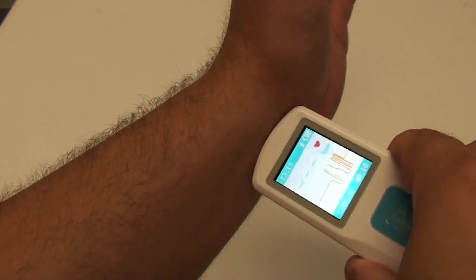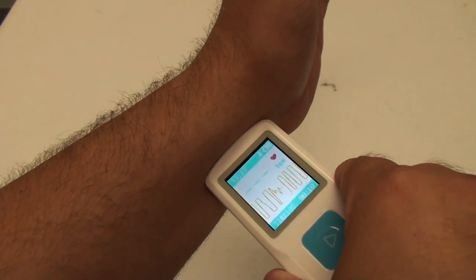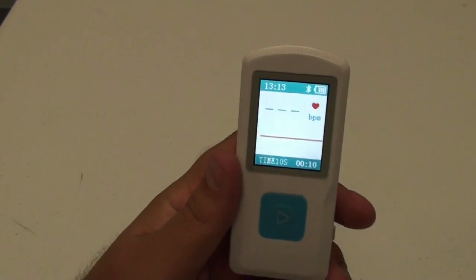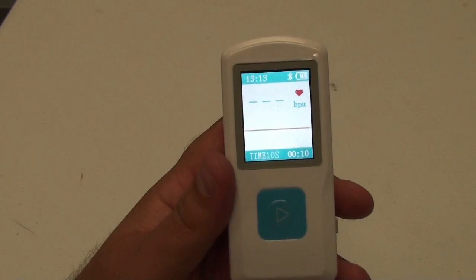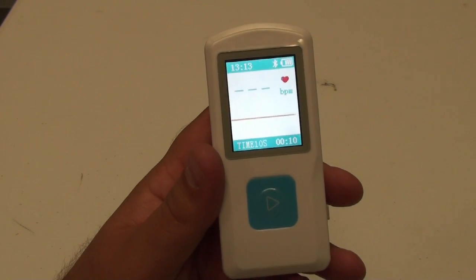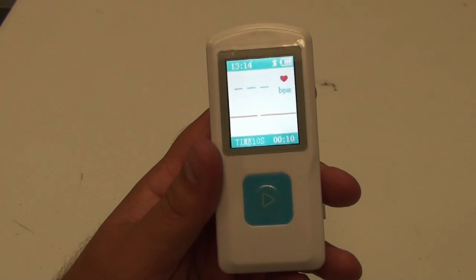You'll also be able to put it on your wrist. All the data can be synced wirelessly using the app PHMS, which you can find in the Google Play Store or in the iTunes Store.